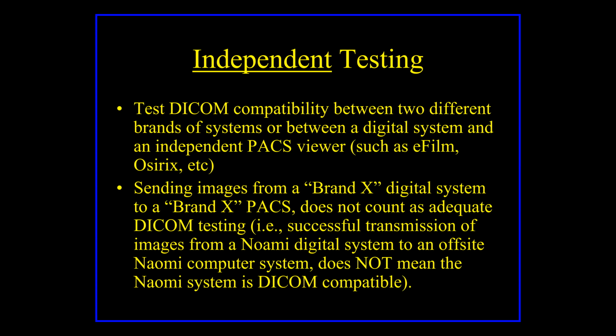Okay, so how do you know if your system is DICOM compatible? Again, I want to be able to send my x-rays from my x-ray machine, no matter what brand it is, to your DICOM viewer so you can view those images no matter where in the world you live, no matter what brand you have, right? And so I want to make sure that it will work when I try to send the images.